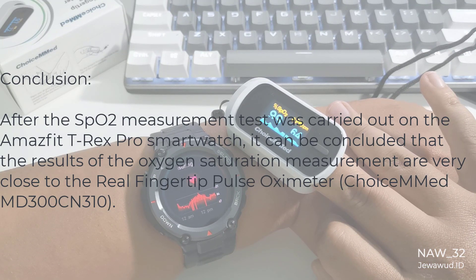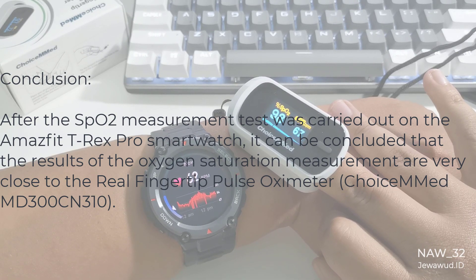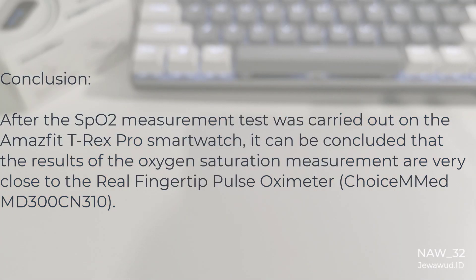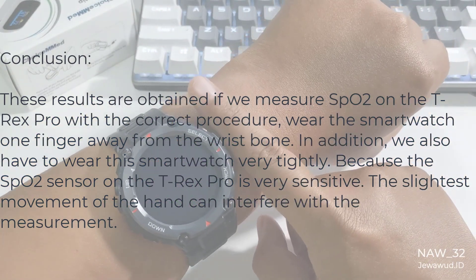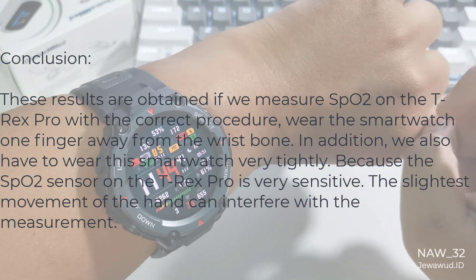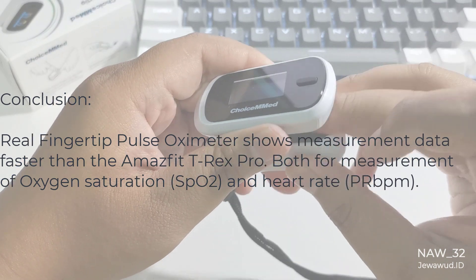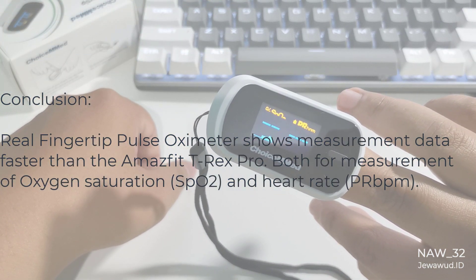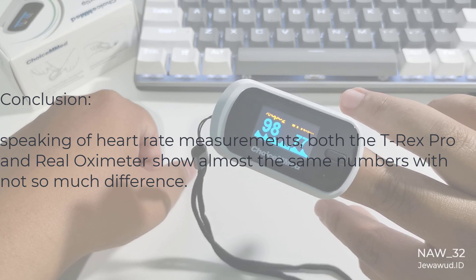After the SpO2 measurement test was carried out on the Amazfit T-Rex Pro smartwatch, it can be concluded that the results of the oxygen saturation measurement are very close to the real fingertip pulse oximeter, ChoiceMED MD300CN310. These results are obtained if we measure SpO2 on the T-Rex Pro with the correct procedure: wear the smartwatch one finger away from the wrist bone, and wear it very tightly, because the SpO2 sensor on the T-Rex Pro is very sensitive — the slightest movement of the hand can interfere with the measurement. The real fingertip pulse oximeter shows measurement data faster than the Amazfit T-Rex Pro, both for SpO2 and heart rate. Speaking of heart rate measurements, both the T-Rex Pro and the real oximeter show almost the same numbers with not much difference.